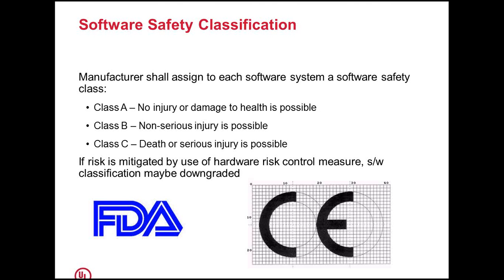And if there are additional hardware support mitigations available to take care of any failures in your software, then the classification can be downgraded by one level.